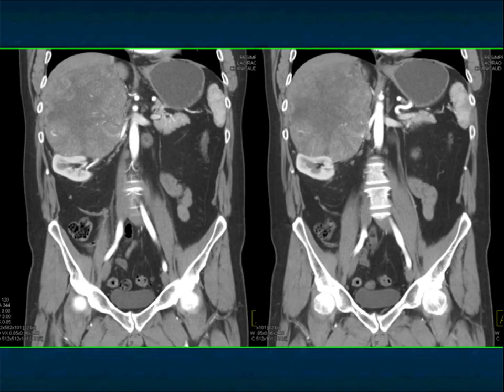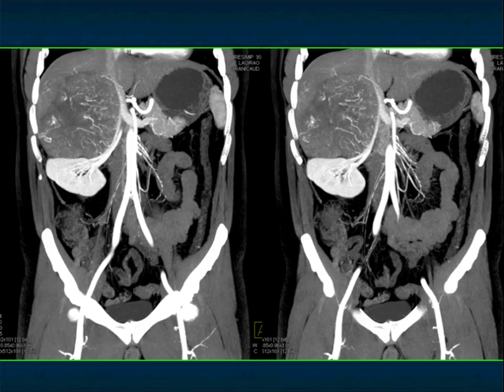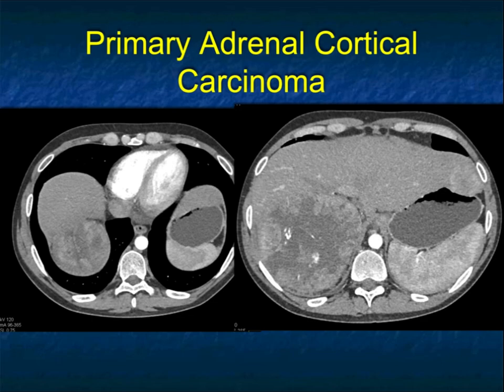Another example: a large mass with mottled enhancement, very much like the previous case. Displacement of the kidney, compression of the liver. At times people confuse this with a primary hepatic tumor when they have less experience, but the coronals and sagittals make it easy. MIP imaging is very good for looking at vascularity — you can really appreciate the irregularity of the vessels, which is a good sign of primary adrenal cortical carcinoma.